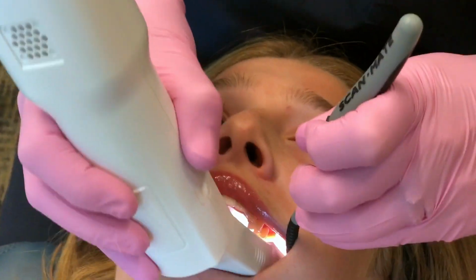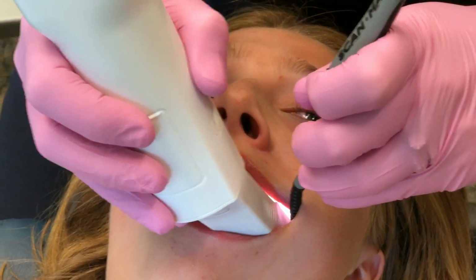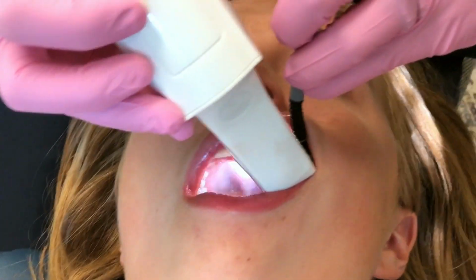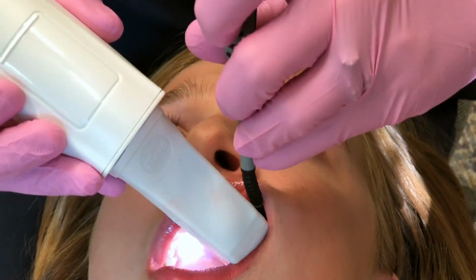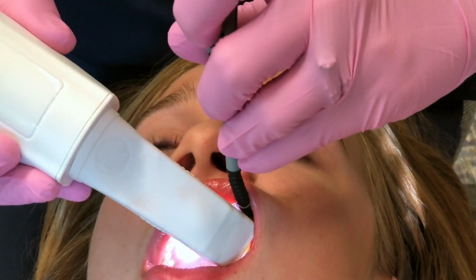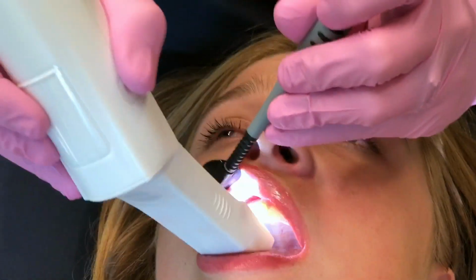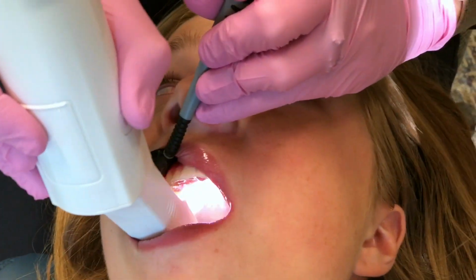This is a good spot to get distal to the molars, the terminal molars, because often that tissue, the cheek, gets in the way. Look at that beautiful scan.